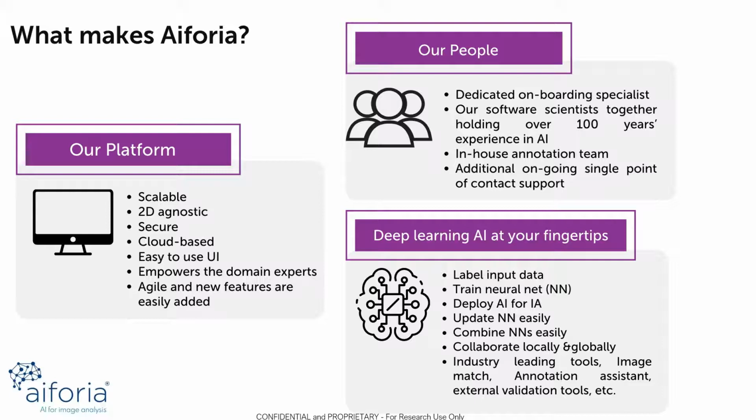So our people, we do have dedicated onboarding specialists, but our whole team really is made up of scientists and software developers and engineers. So in that way, you don't need to know how to code. You don't have to be a data scientist to be able to use our platform. You don't even need a dedicated computer, actually. You don't need your own dedicated GPUs. We provide all of that for you.